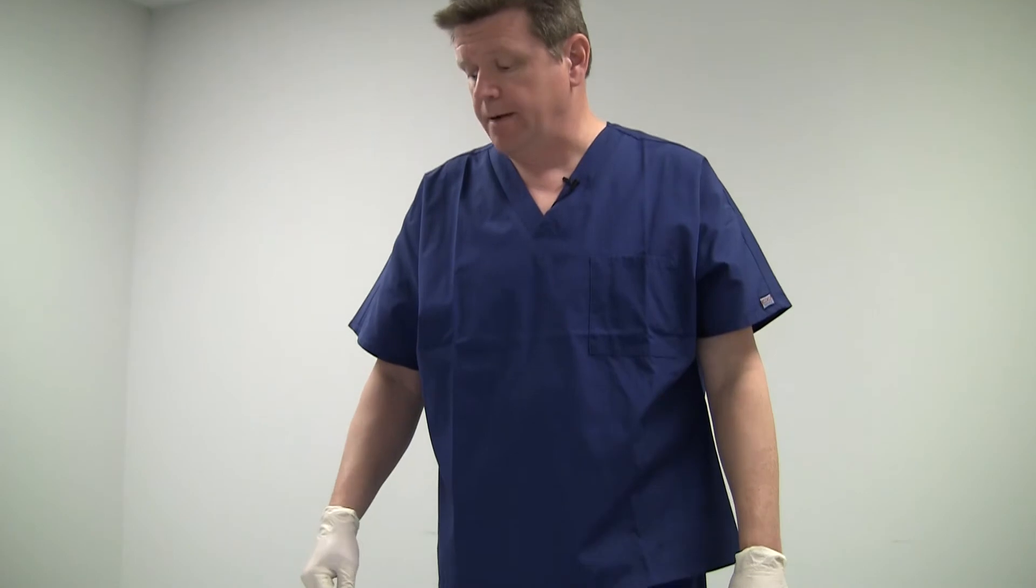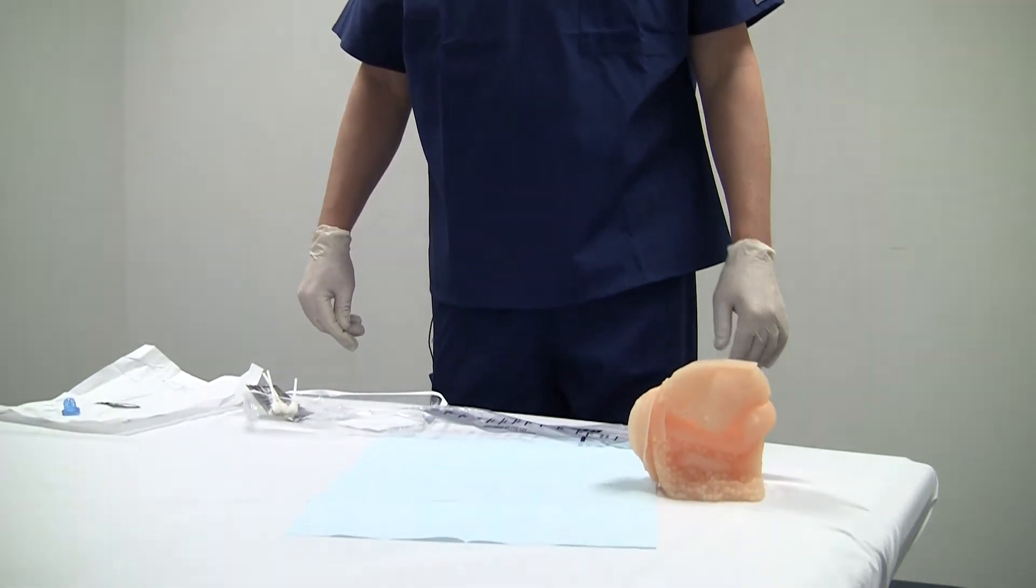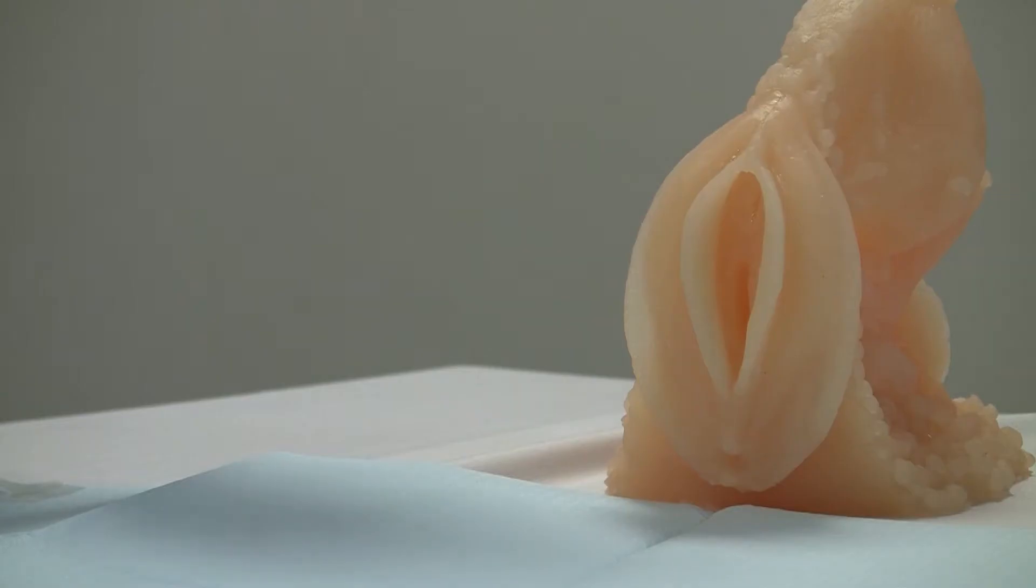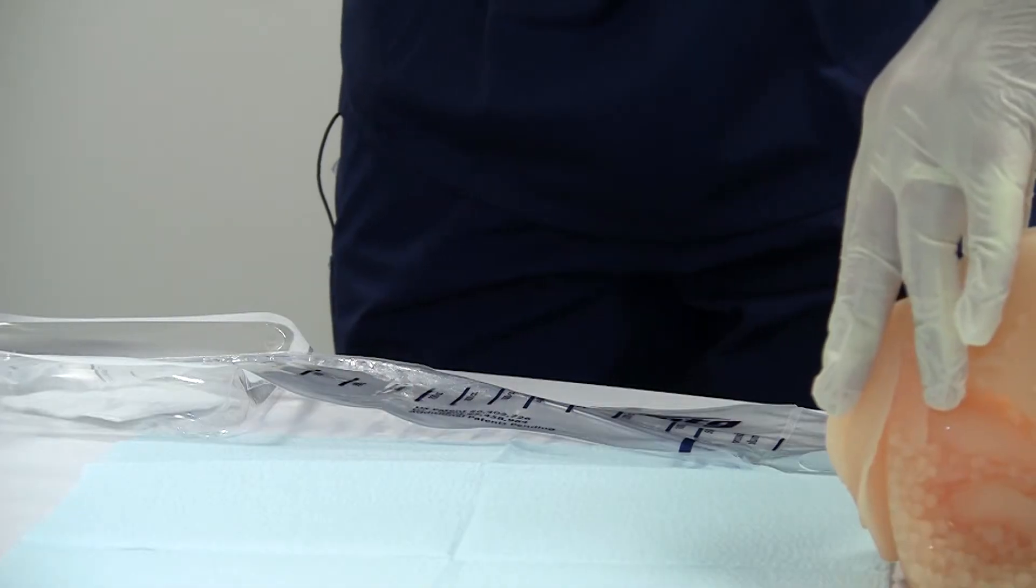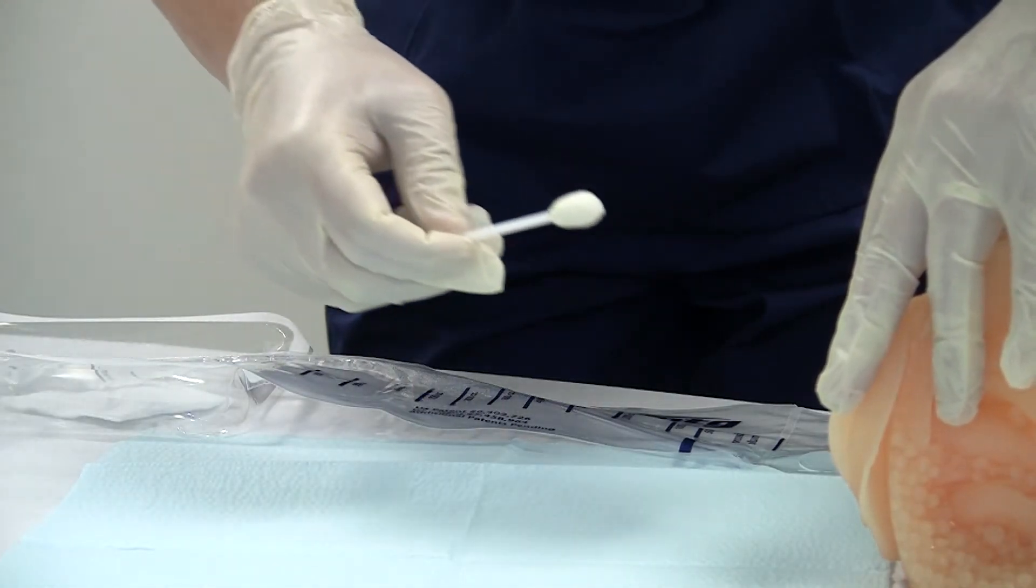I've gone ahead and donned my gloves. I've opened up the swab package and got them ready to go. Now, I'm going to go to the patient and I'm going to spread the labia with the two fingers of my left hand, just like so. Just like before, I'm going to use my right hand to do all the advancements.